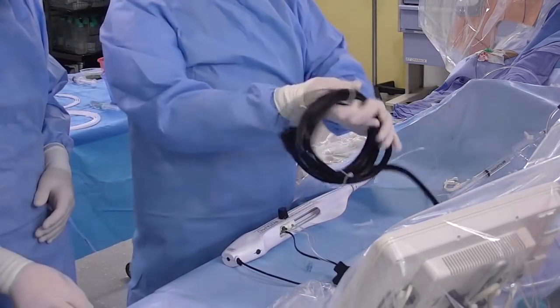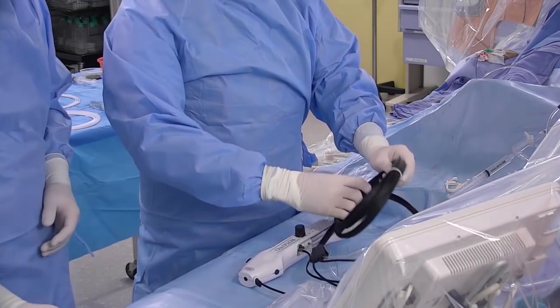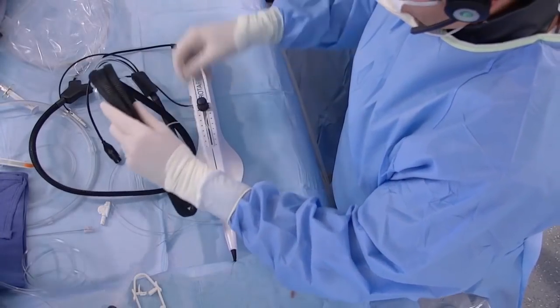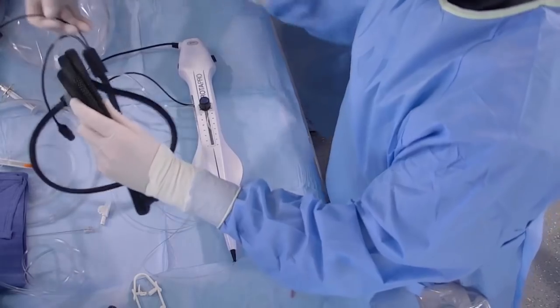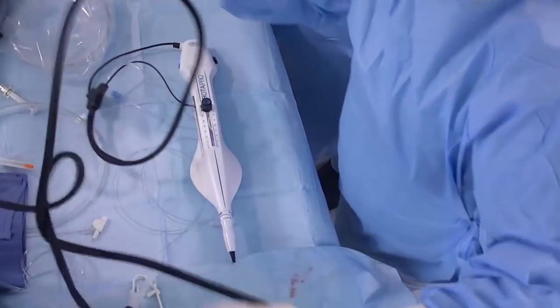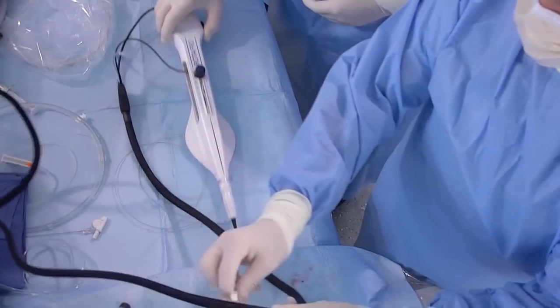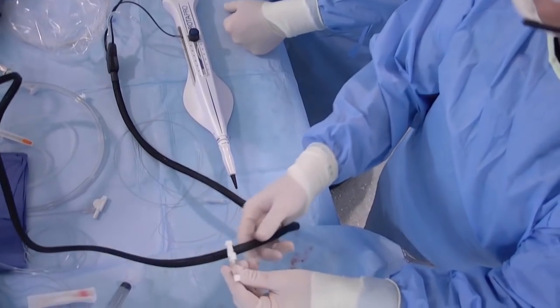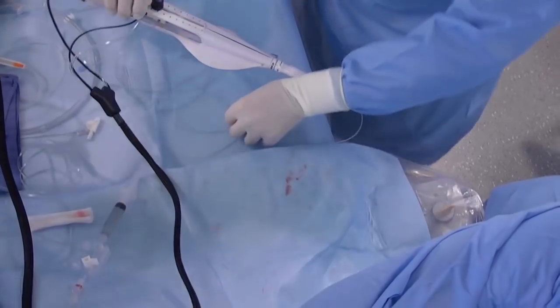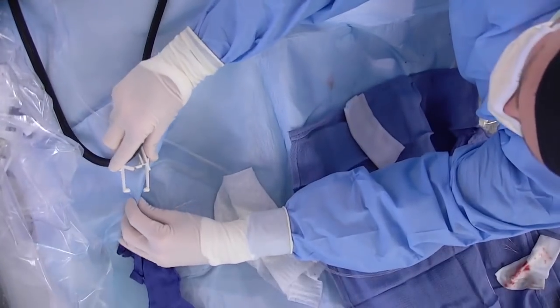This part is quite huge, and you have to place it the right way to ease the use. So I will start by using this, and I put the clip, as you can see here, and I advance the burr in this part. As you can see here, I will clip here.